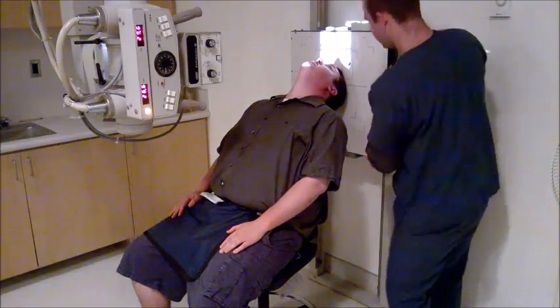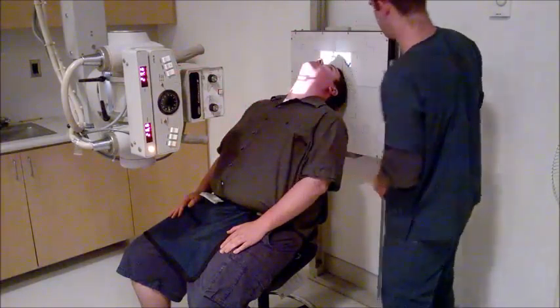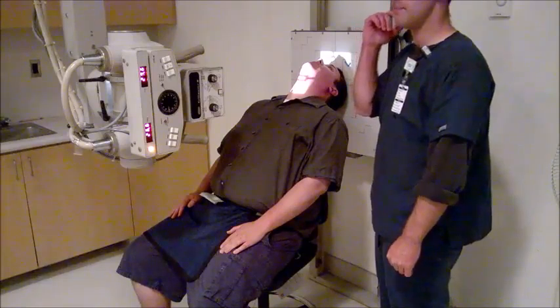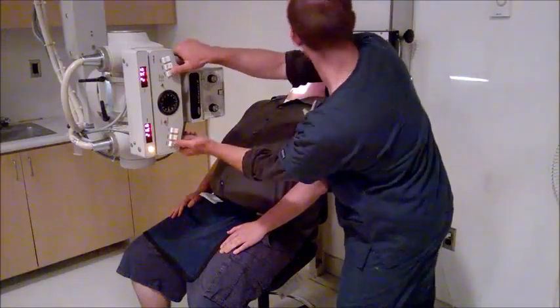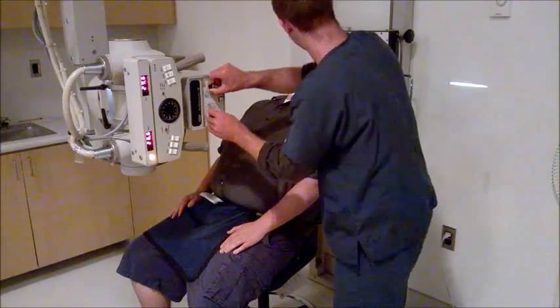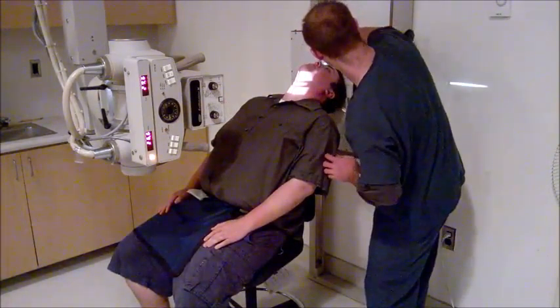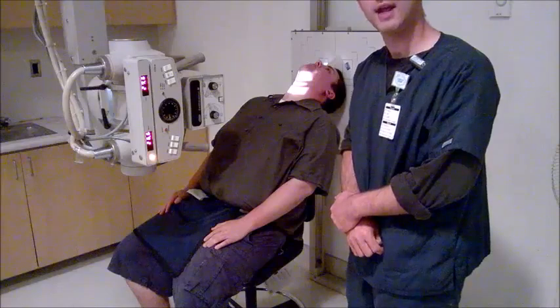There we go. And now the CR. CR should enter 3/4 of an inch anterior to the EAM, the external auditory meatus. So right about that. Yep, that's perfect. Alright, now collimate. There we go. Off to the left a little bit, sir. I'll put my marker on the left side, and I'll shoot this at 70 kVp at 20 mAs.